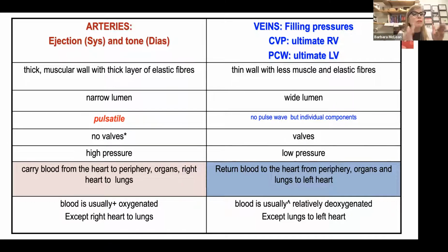If you've got a CVP catheter, you should always hook it to pressure tubing, to a transducer, to a fluid bag that's under 300 millimeters of mercury, so that you can continuously monitor venous pressure. Okay, so that's for your CVP. You know to do it for the A line; you should also be doing it for the central line because that's going to give you an abundant amount of information.